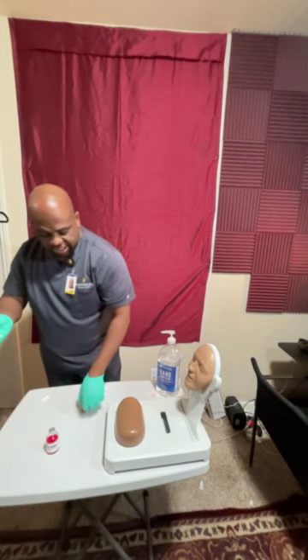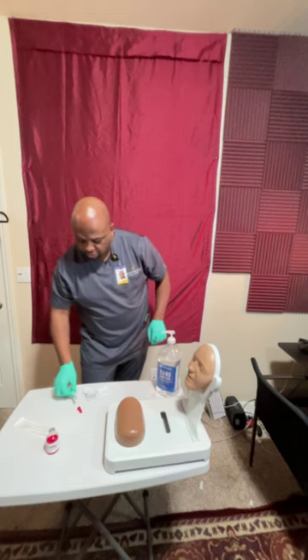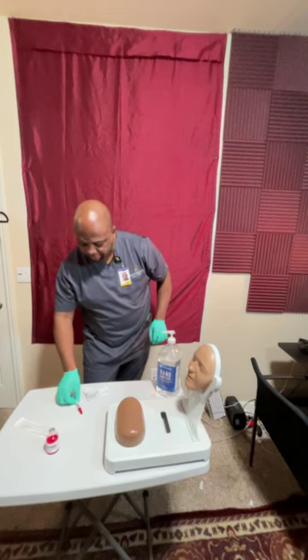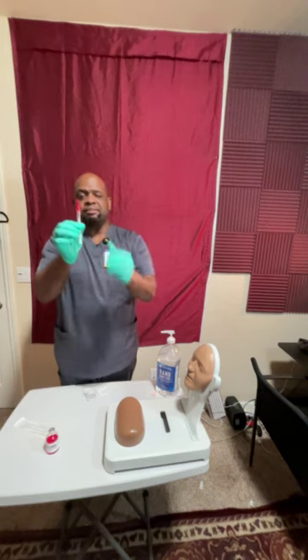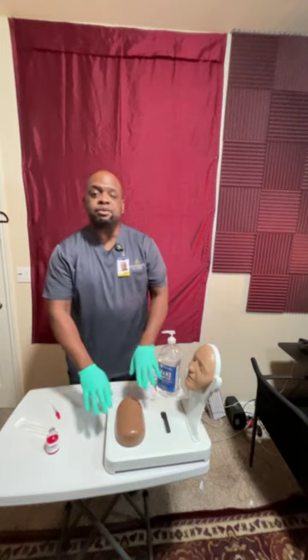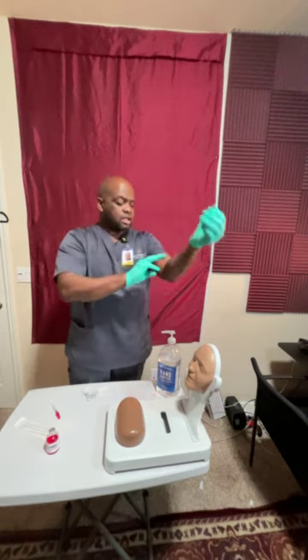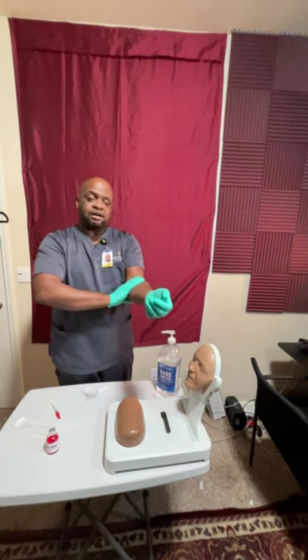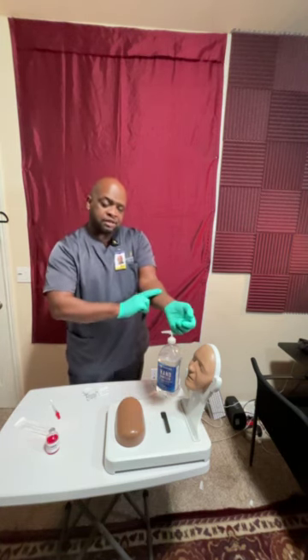Because I still need to prep the patient for this procedure, I'm going to do a one-hand scoop to recap this syringe, right? One-hand scoop. I'm going to put that back on. Now, as I said, I'm going to prep the patient. So what I need to do is find the proper site, right? This is going to be 3 fingers below the wrist and 4 fingers above the antecubital space of the forearm. It's going to be right in this area here.